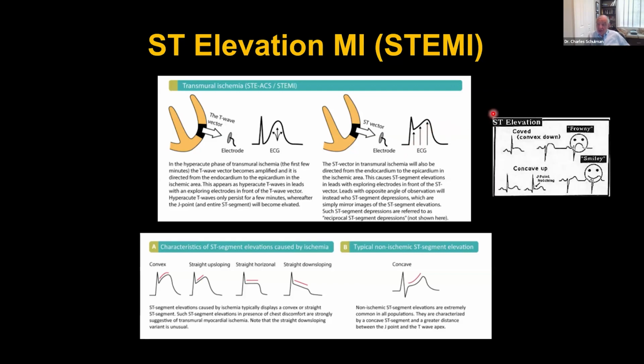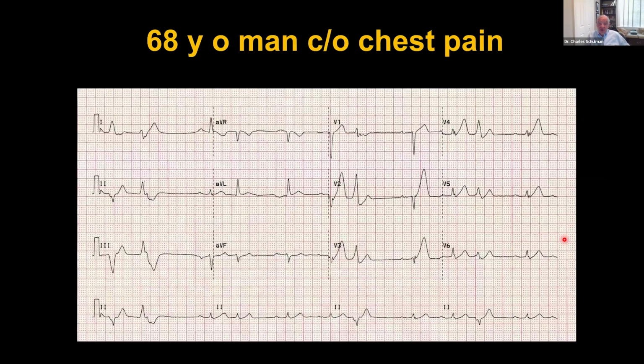Okay. One way you can look at the seriousness or not of ST elevation is that the frowny face is serious. The smiley face is not. So here's a 68-year-old man who came to the emergency room complaining of chest pain, and here is his electrocardiogram.